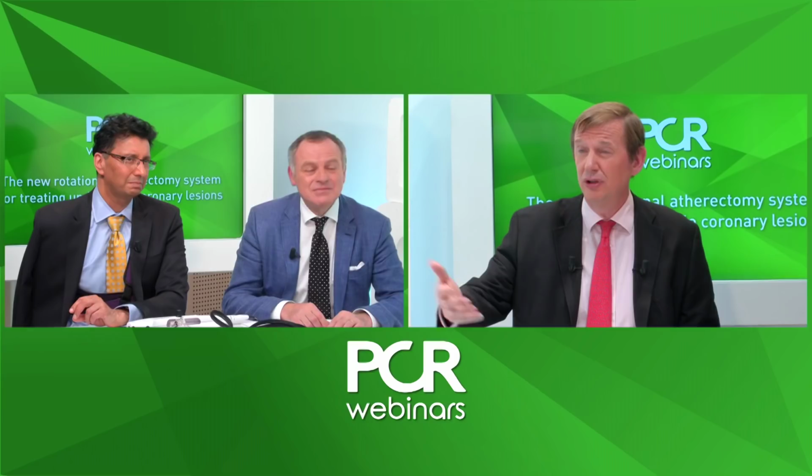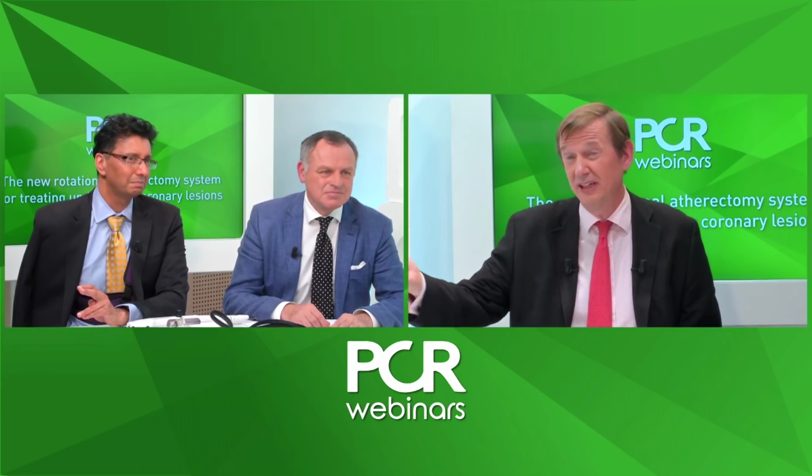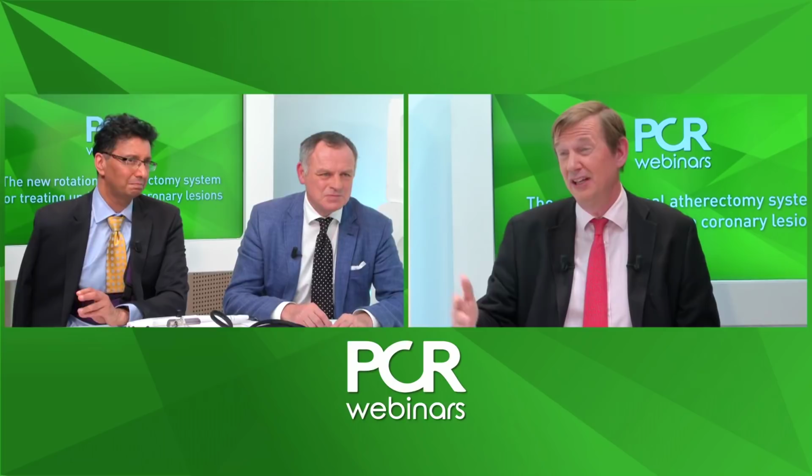Bruno, one of the other things that can happen is if you are too aggressive, you can get no reflow. Yeah. Something, again, strongly associated with it, but rarely seen in day-to-day practice. Let's imagine you did have that. Do you have any tips about treating it, or perhaps even avoiding it? It's a long time since I have seen no reflow, because now we are using smaller burrs and very short runs. It's something that's very rare.